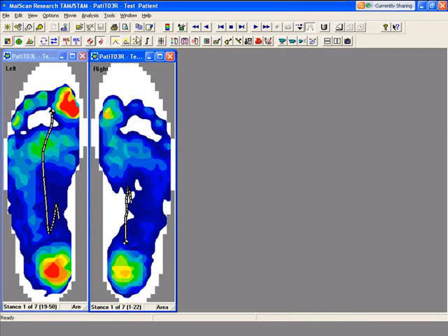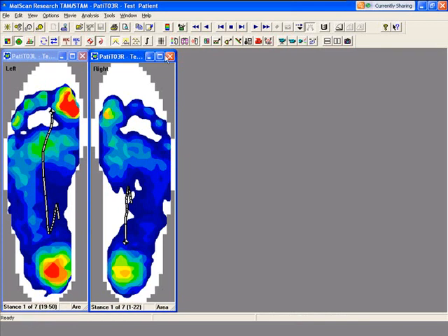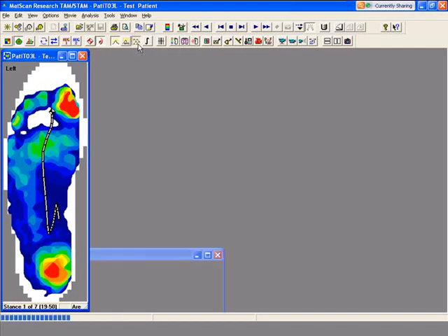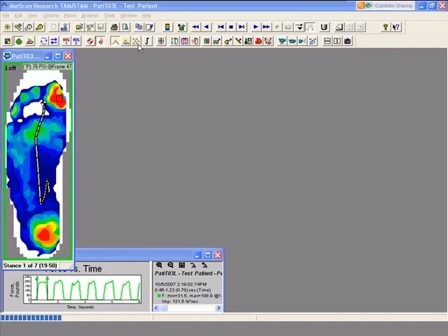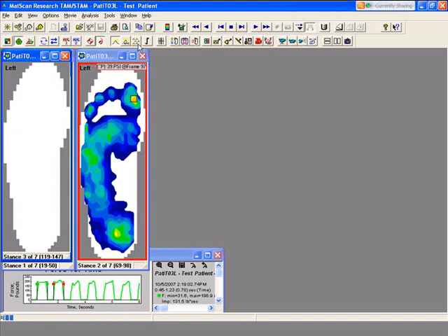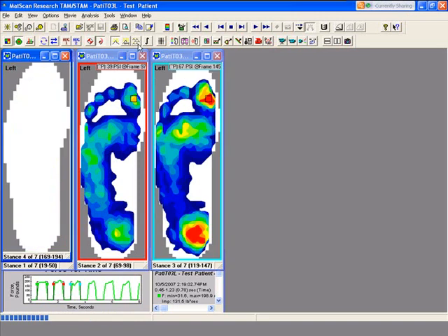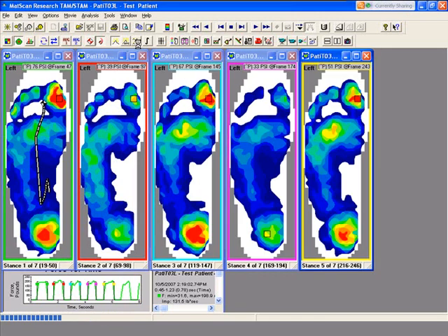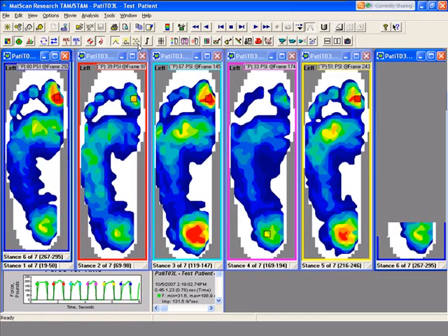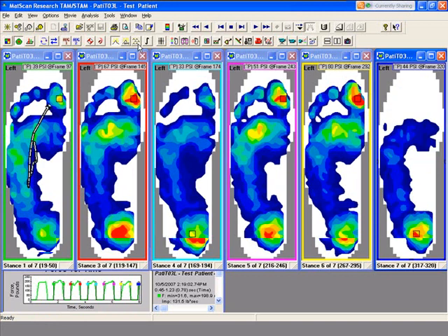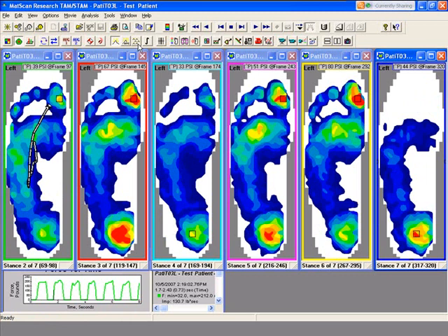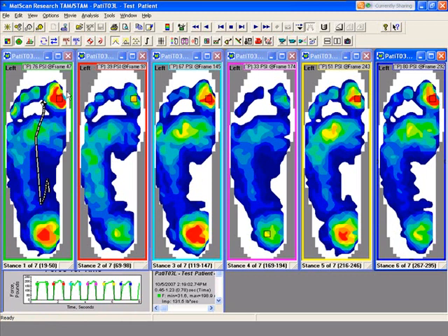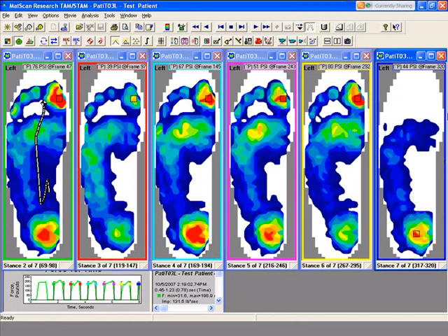The next icon is called multi-peak. You're able to look at each foot strike at one time. I'm going to click on the multi-peak and we're going to look at the left foot. We took seven foot strikes, so now we can look at all of them at once. By clicking the right or left arrow, you can see it'll only show six at a time, but if I click my right arrow, now I can look at number 7 of 7.